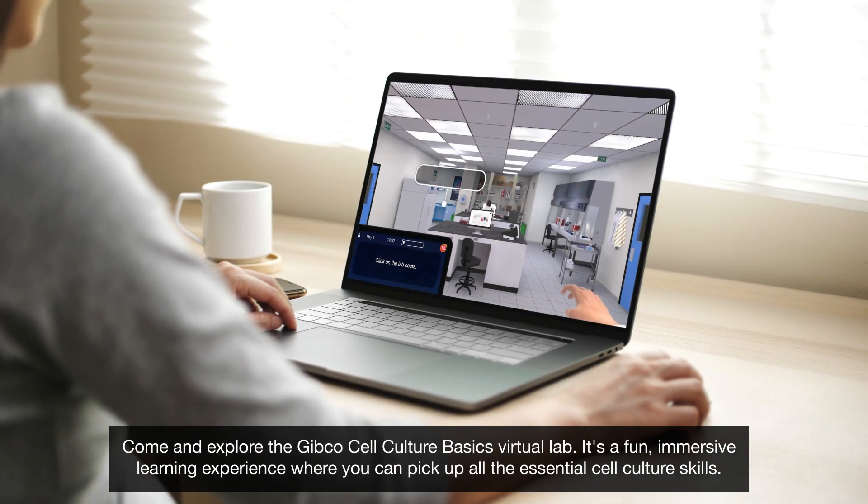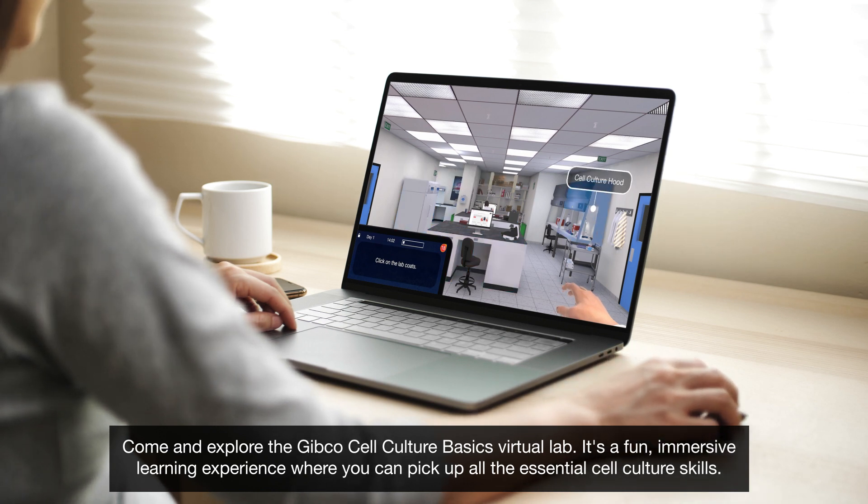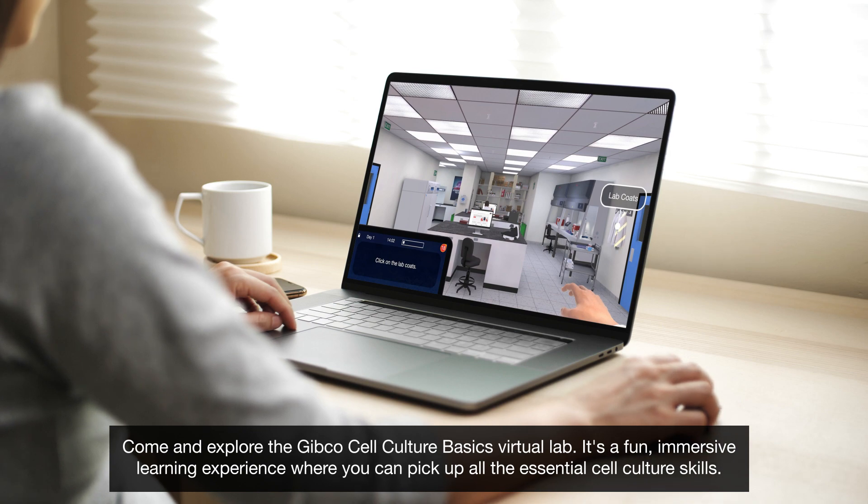Come and explore the Gibco Cell Culture Basics Virtual Lab. It's a fun, immersive learning experience where you can pick up all the essential cell culture skills.